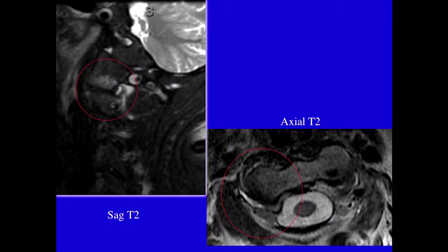So patients have brain MRs for headache. They also have cervical MRs. And unless we go way out laterally, like on the sagittal T2, we may not necessarily see it. Or even if we cover it, we may not recognize it.